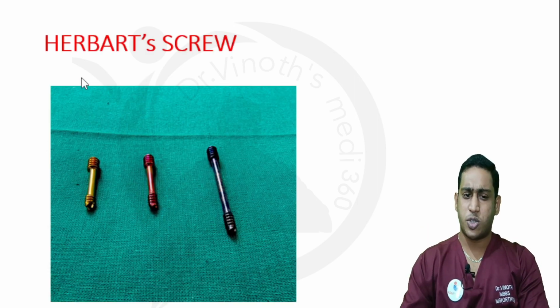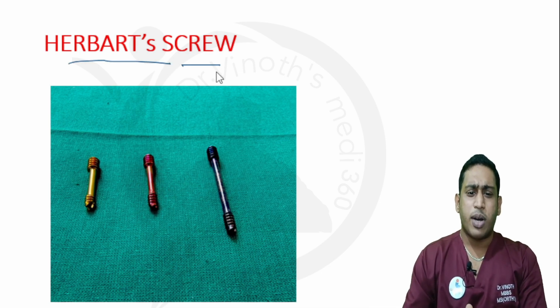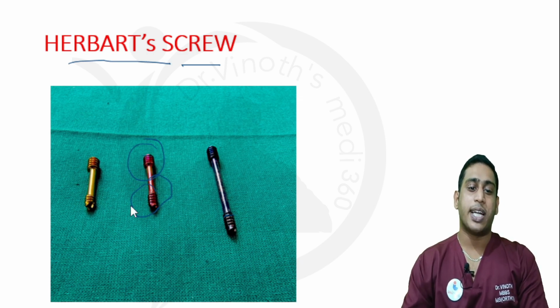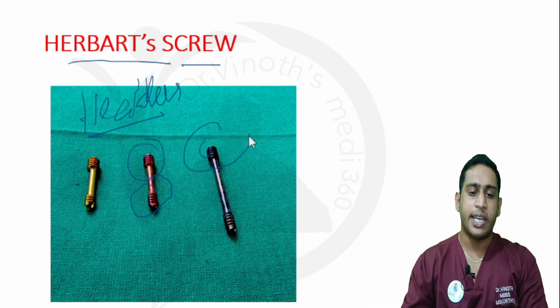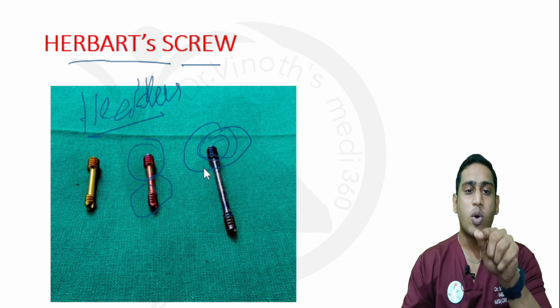Then coming to the third screw, it is called a Herbert screw. What is the difference between the Herbert screw and the normal cancellous screw? It also has widely pitched, thick threads at the distal surface. In the Herbert screw, there are threads at both the proximal as well as the distal aspect. And one more thing, it is called a headless screw, as there is no head here. So this part also will lie within the bone surface.